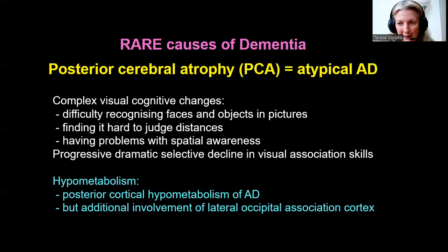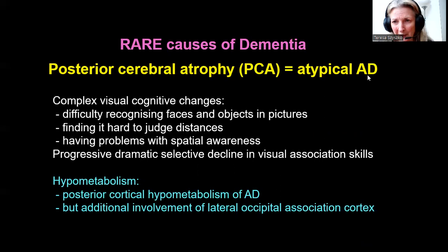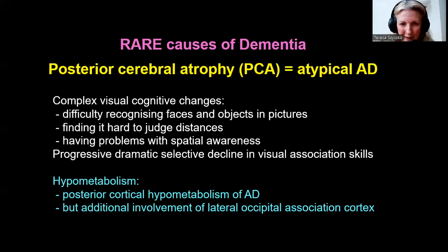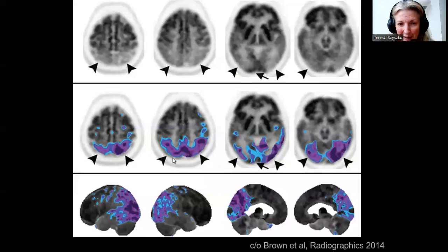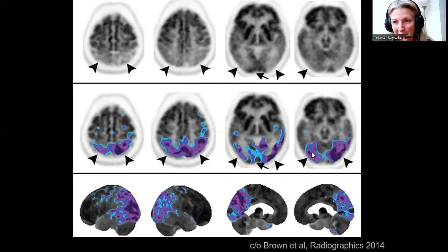There are some rare dementias worth mentioning. Posterior cortical atrophy is the same as atypical Alzheimer's disease, with really extensive posterior hypometabolism — the whole posterior region including the posterior cingulate, occipital lobe, parietal lobes and into the temporal lobes is reduced, but the temporal lobe is less affected than the occipital, parietal lobes and posterior cingulate gyri. Here's an example showing extensive hypometabolism posteriorly affecting the posterior cingulate, parietal and occipital lobes, not as severe in the temporal lobes — that's why it's non-amnesic.